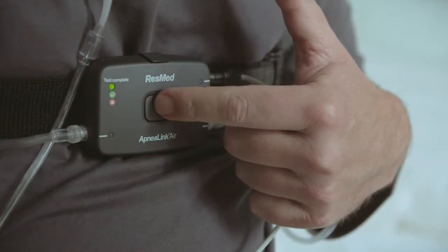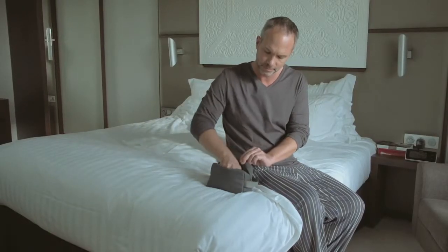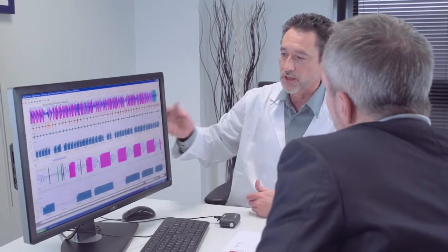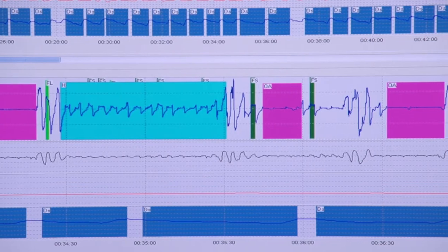Press the on-off button another time until the test complete light turns off and return your ApneaLink Air system to your clinician for the analysis. The ApneaLink Air has now recorded a wealth of data about your sleep patterns. This data is downloaded and analysed on your clinician's computer. Your clinician will be able to assess whether or not you are suffering from sleep disordered breathing. But rest assured, there are simple therapies that can be offered to treat these conditions and relieve you of the debilitating symptoms. Your clinician will happily tell you more about your options.